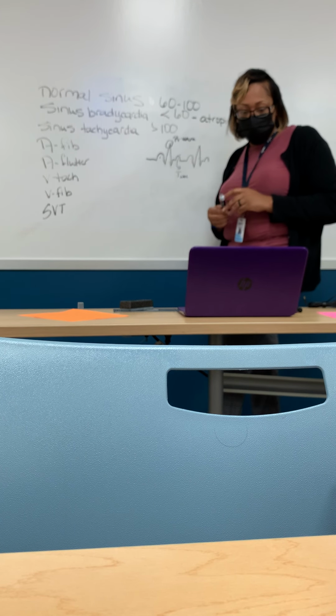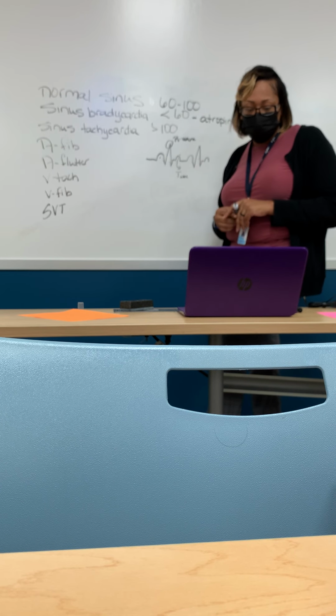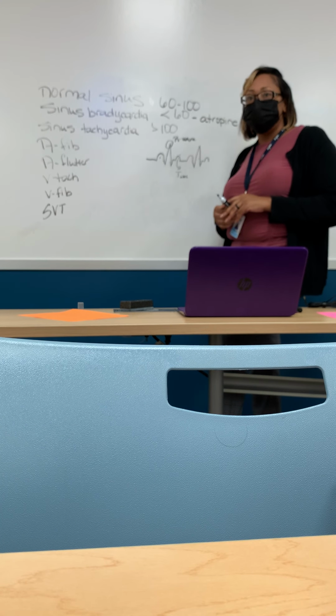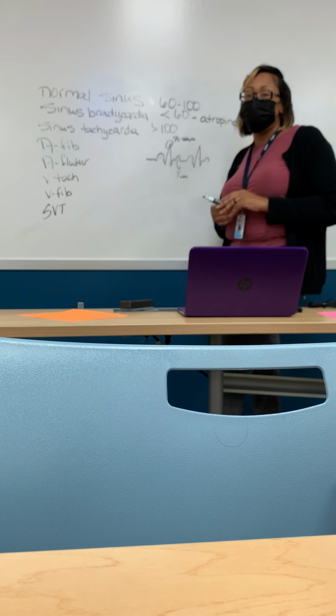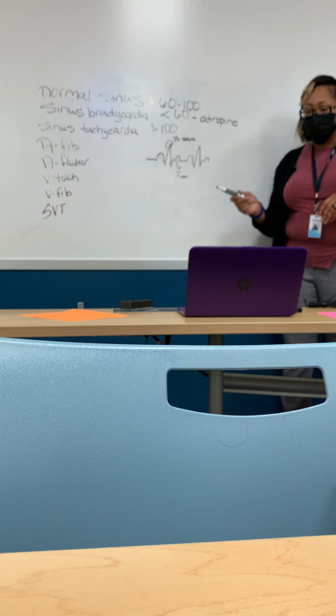It's a little P, right? It's a little P. It's there. How many you got? 140. You got 140, yeah. Greater than 100, sinus tach.